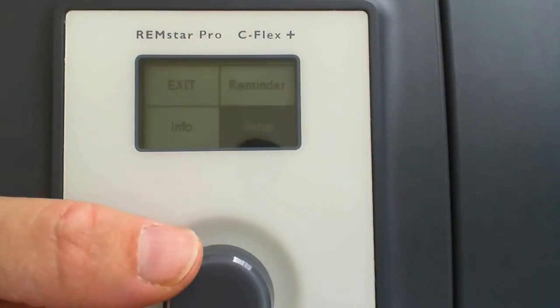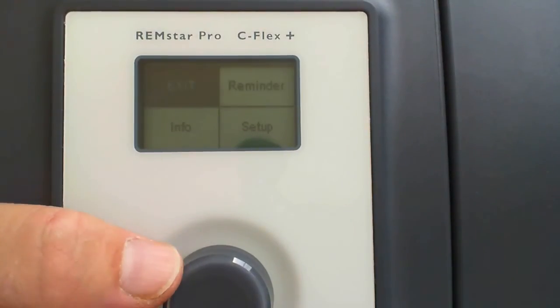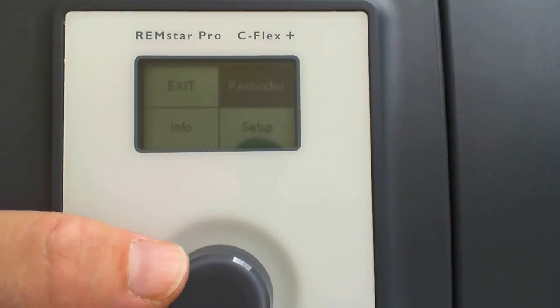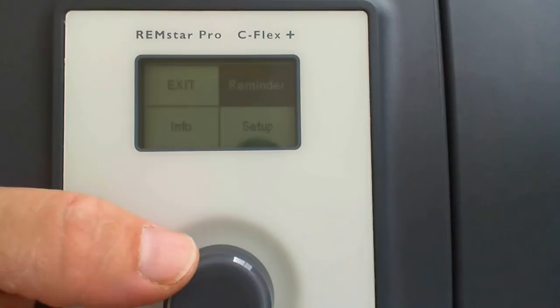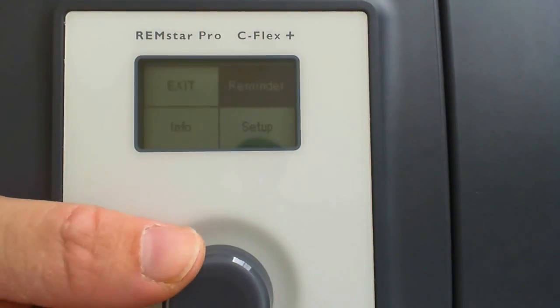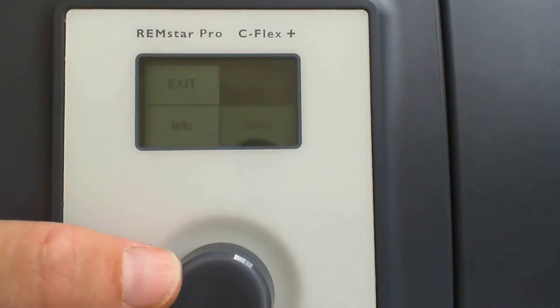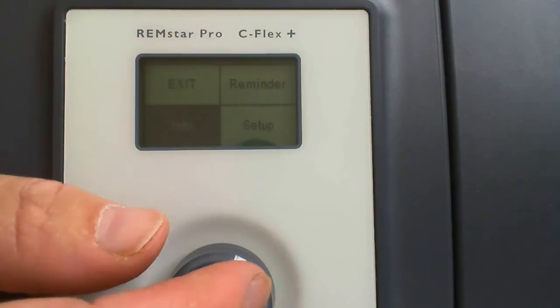It's also a good reminder if you're having trouble changing out your filters on time, or if you don't check them that often. It's a good thing to have set up for you, just as a reminder to change your filter every 30 days. So there's some good features in there. A lot of times we're going to use it as a sales tool. Hey, that's fine. There's a real business to be had. Exit, of course, exits you out of this menu into the patient section.